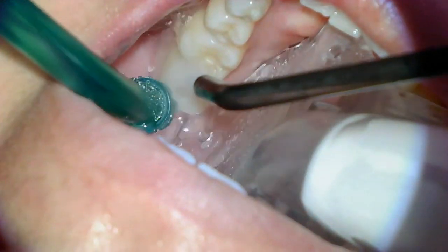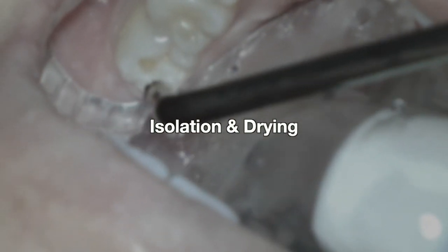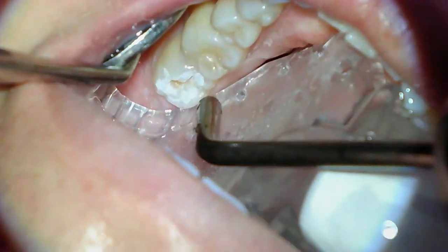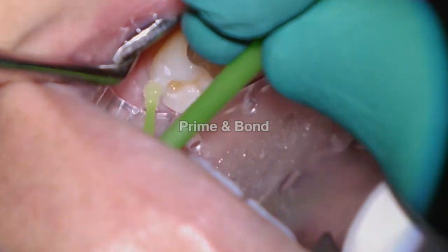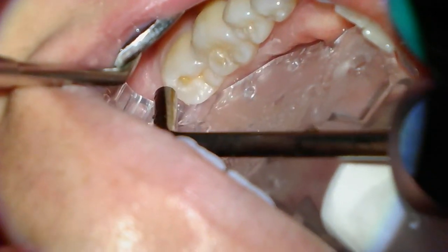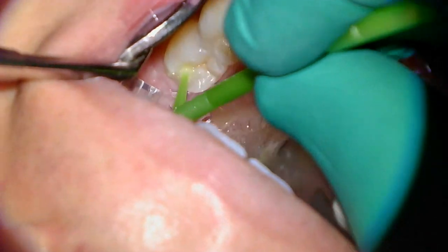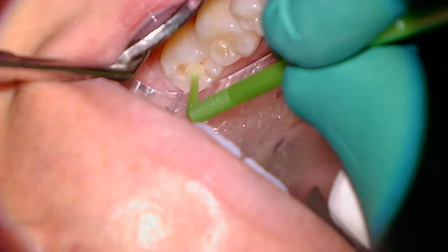Then we're going to rinse the tooth really well and start the process of isolation and drying — this is really where the dry shield is going to help us isolate really well. Then we're going to start applying the prime and bond. This video shows a two-step technique: the primer is applied for 20 seconds and air dried, then the bonding is applied for about 15 seconds, air dried and cured, before we start building up the tooth with the resin.